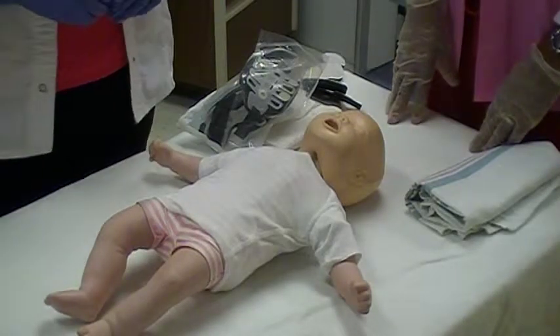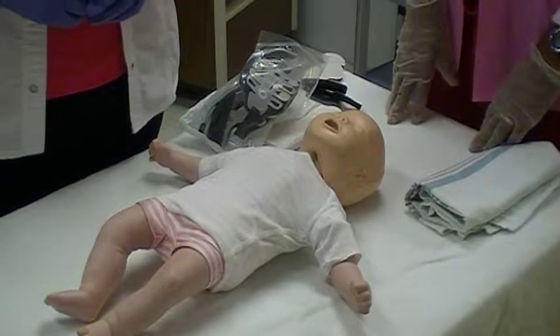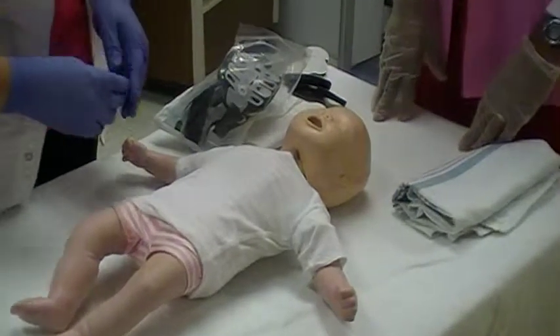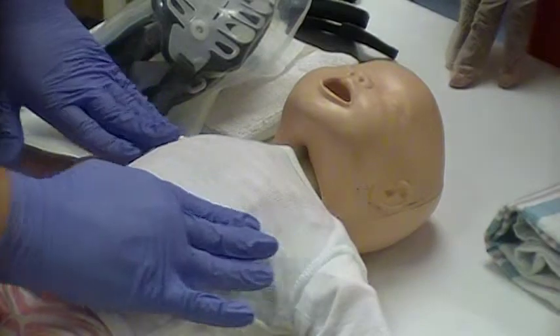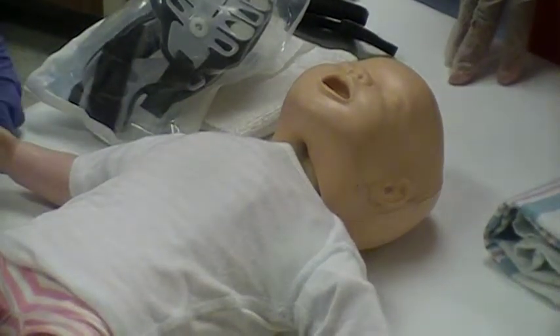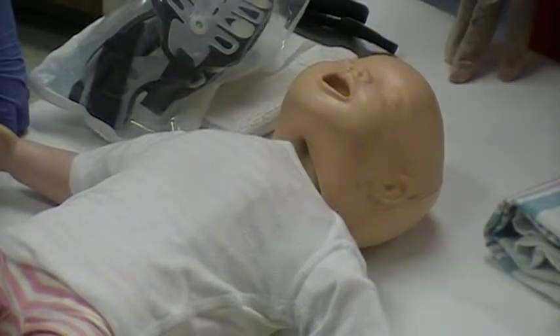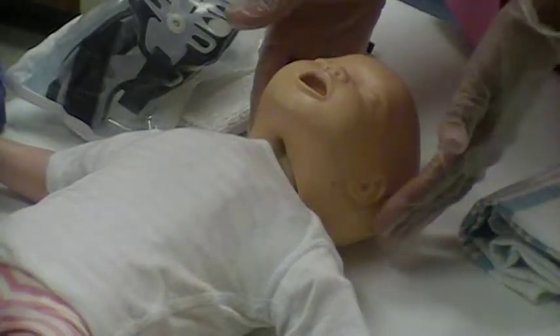Cervical collar application and maintenance. Assess the child's skin for injuries, especially in the neck and upper torso. Use spinal precautions and the log roll technique throughout the entire procedure. Have an assistant positioned at the child's head to initiate manual cervical spine immobilization.